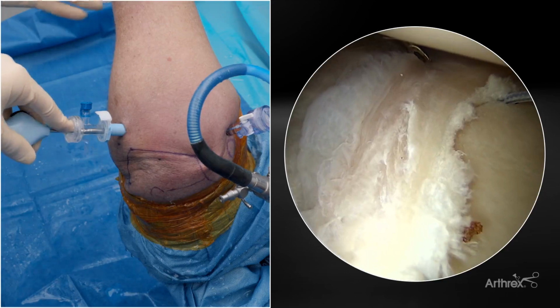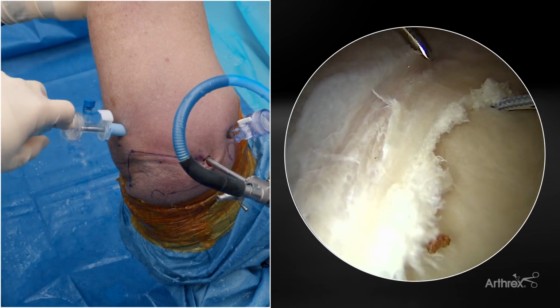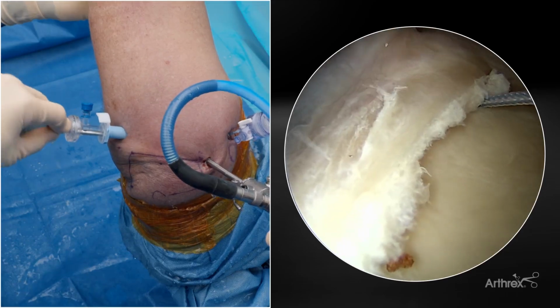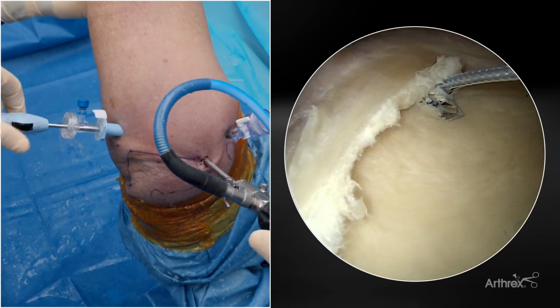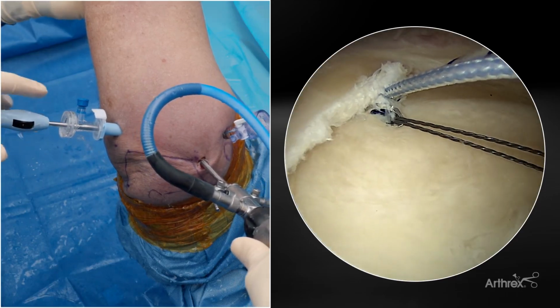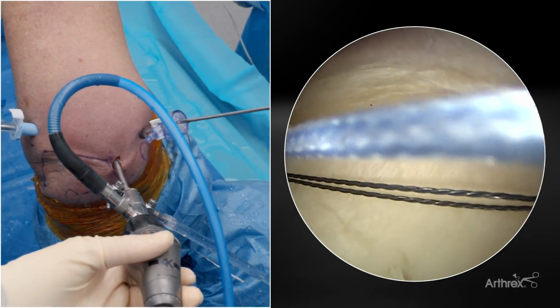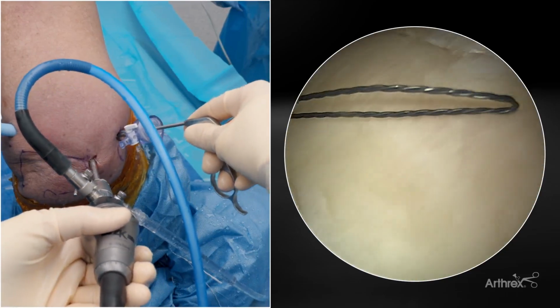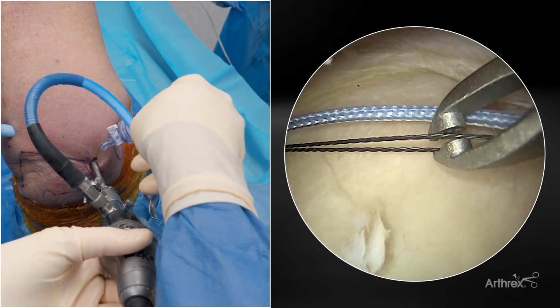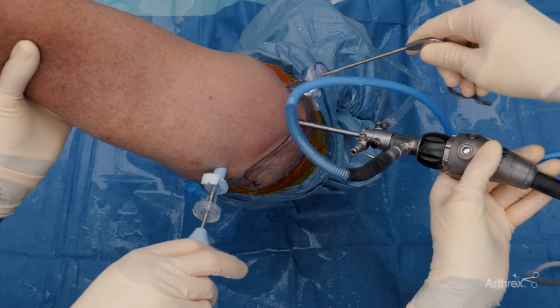As I'm doing that, we're going to just get behind the labrum here. The amount of capsule that you're going to grab depends on the pathology. Certainly, some patients we're going to need to do a big capsular shift too, but we're going to pass this through, a three-dimensional move that we're doing there. We're going to get our suture lasso and then come back through our anterior cannula and grab this to retrieve this out. So now we have this. You can load these in the joint if you need to. We're going to go ahead and feed that on this side as we pull it through. That way there's no tension.